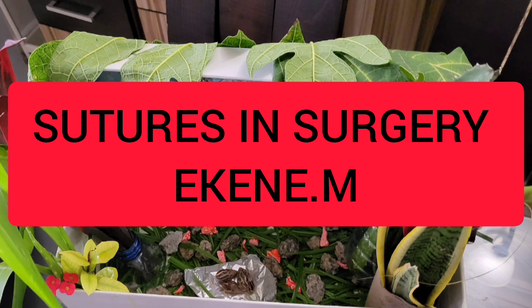And the rule is aimed at helping you to determine the length of suture you are going to use, or degree of approximation so that you oppose the wound. It also helps you to prevent local devascularization of the sutured wound, to know where to apply bites in terms of distances.